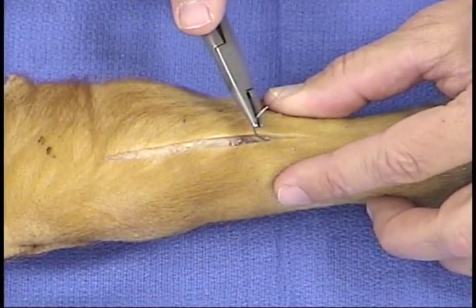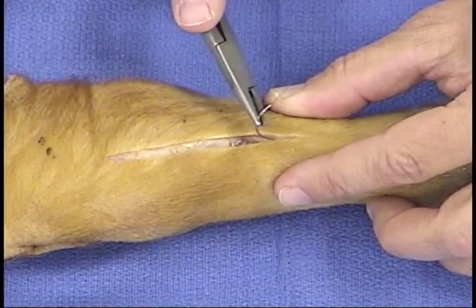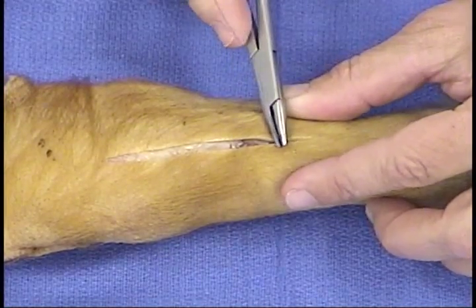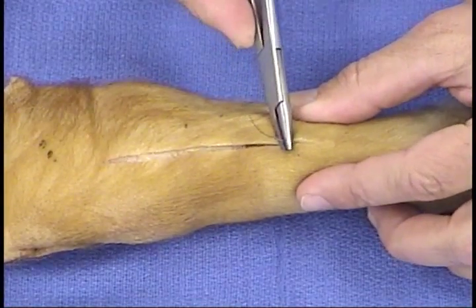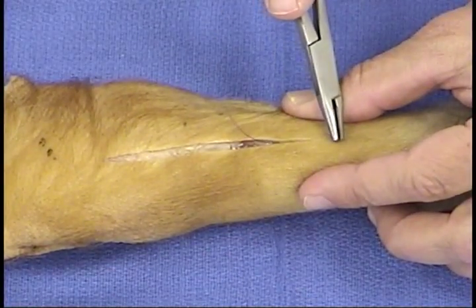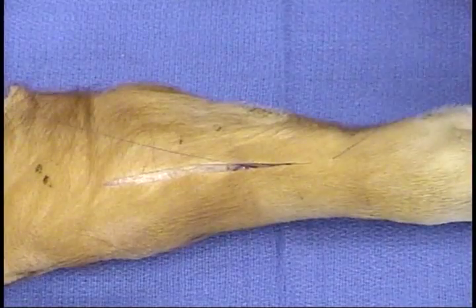When surgeons close skin with an intradermal layer, it can often be a little bit tricky to bury the knot. Here's a neat little technique that you can utilize with any size or any type of suture to bury the knot at the commissure.